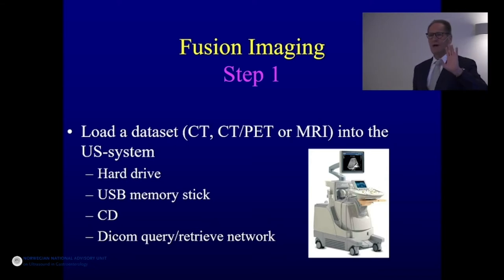You do have to have a CT, MRI, PET CT, or something else with transverse imaging of the same patient. This can be achieved 1 day before, 1 hour before, or 2 years before. It doesn't matter when, as long as it's the same patient, and you can load the images into the system.